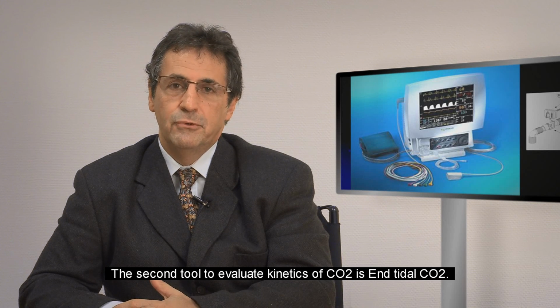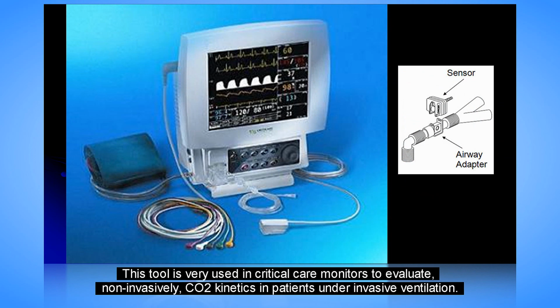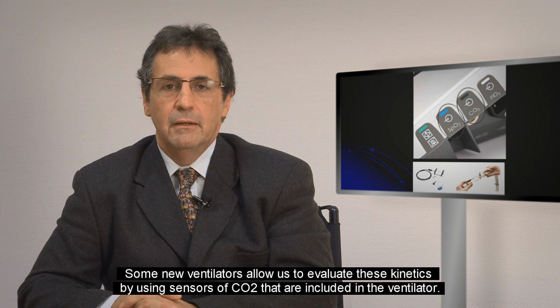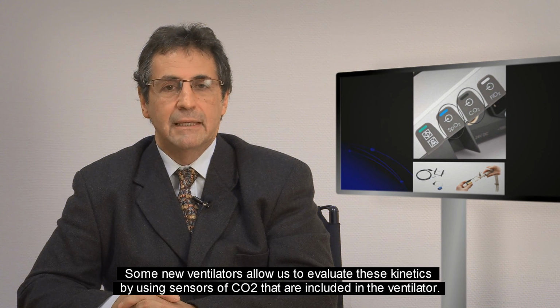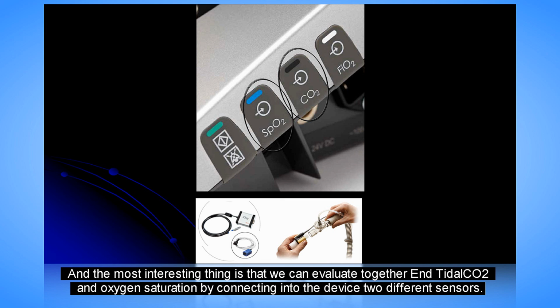The second tool to evaluate kinetic of CO2 is end-tidal CO2. This tool is very used in critical care monitors to evaluate non-invasively CO2 kinetics in patients under invasive ventilation. Some new ventilators allow us to evaluate these kinetics by using the sensors of CO2 that are included in the ventilator. And the more interesting is that we can evaluate together end-tidal CO2 and oxygen saturation by connecting in the device two different sensors.